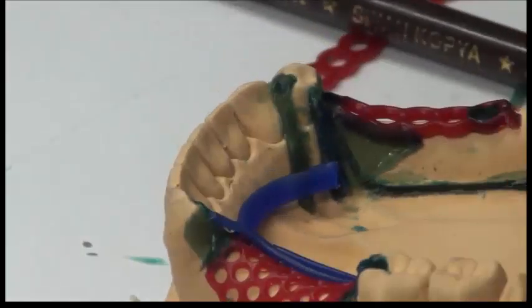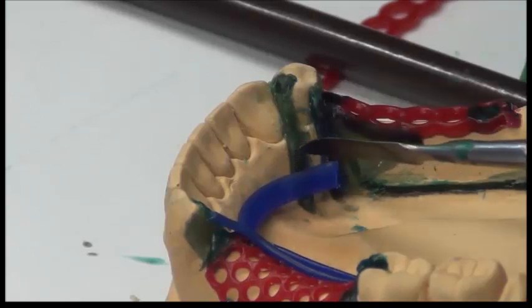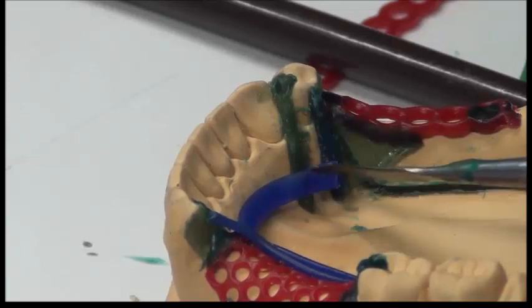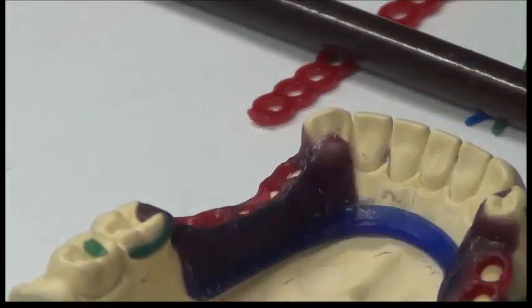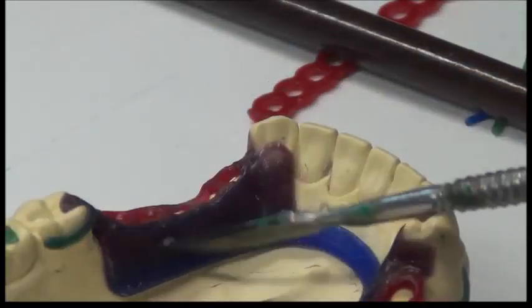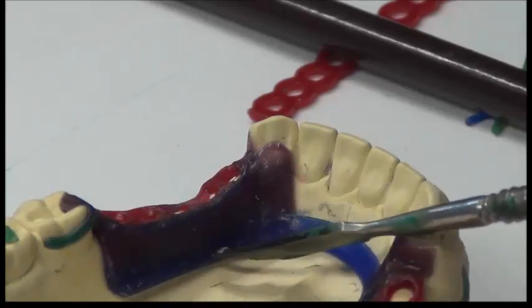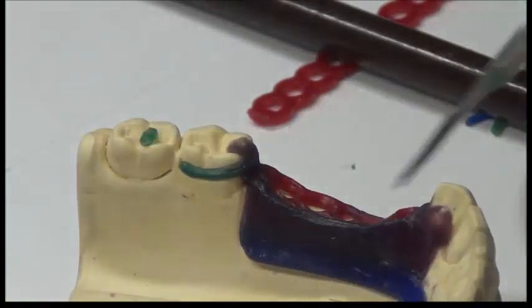And here, I have the same two options we said. Either we cover this with a plate and we join it with the lingual bar, or we simply just join these components together with the lingual bar. Okay? So we preserve the lingual bar shape all throughout the length of it. So once we finish, we have the following smooth surfaces. You can see that I have smooth surfaces between the external finish line and then the edge of the lingual bar. Here it's well adapted to the marginal gingiva.